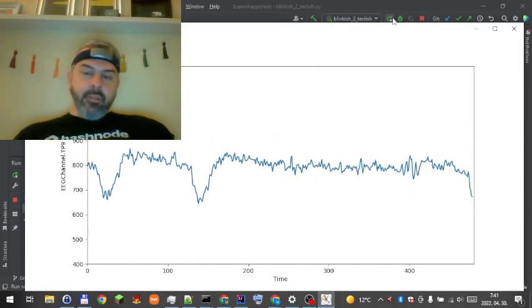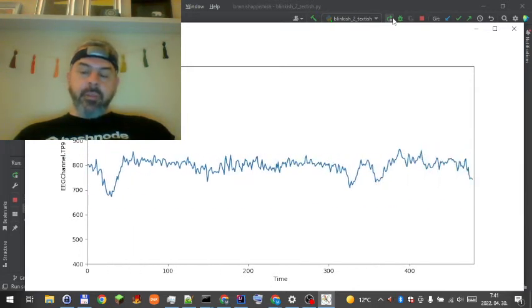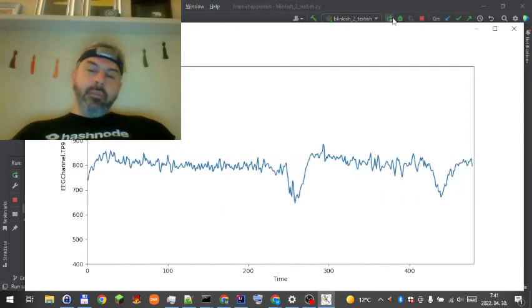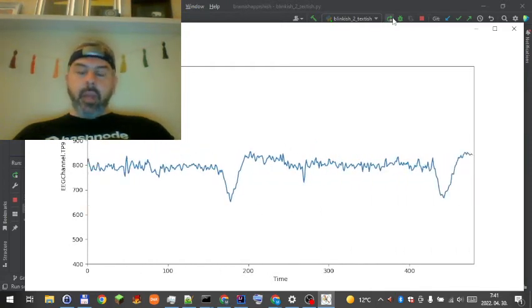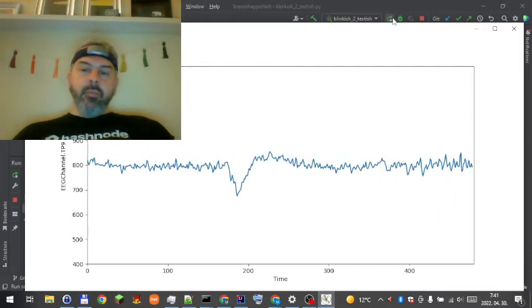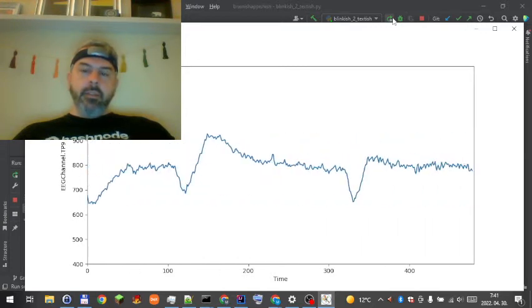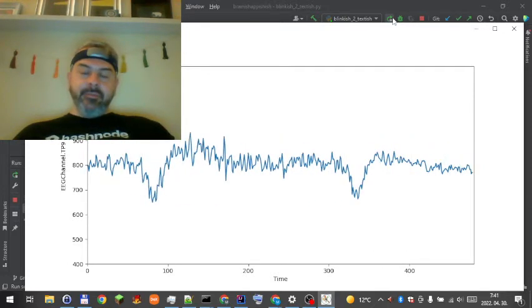You won't believe it, but many things affect your brain waves. For example, your eye movement. You can detect eye movement based on your brain waves. Of course, you have to use multiple channels for that. We are only seeing the TP9 channel because I found this will be the appropriate one to detect eye blinks. But just look here, I will move my eyes. Have you seen it? It's very interesting, I would say.